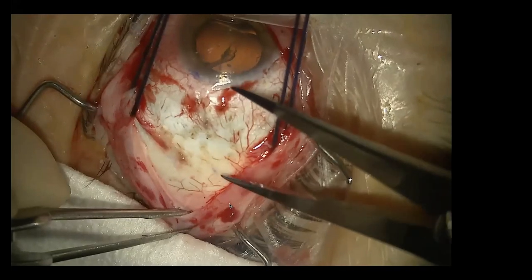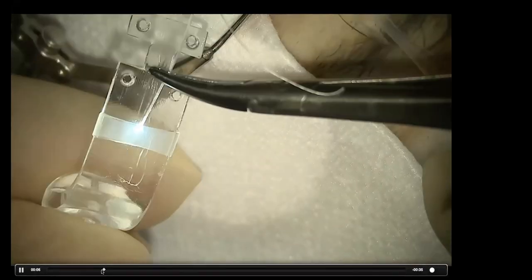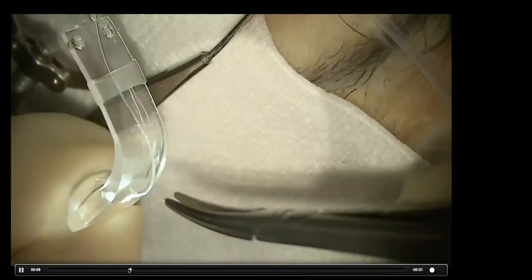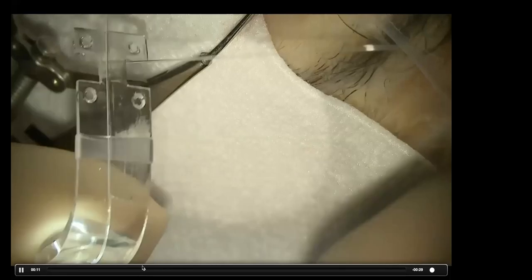This is almost real time. Let me stop and go back. I have isolated the temporal muscle and the superior muscle, and this is the superotemporal quadrant. I am standing in the superotemporal position to face the quadrant directly. I measure 11 millimeters from the limbus and place the first suture. In this case, I have used the light, and as you can see, the light is connected to the buckle by a silicone sleeve.